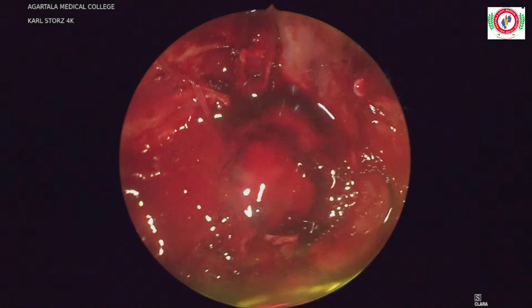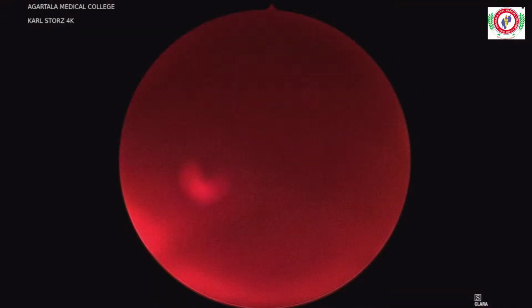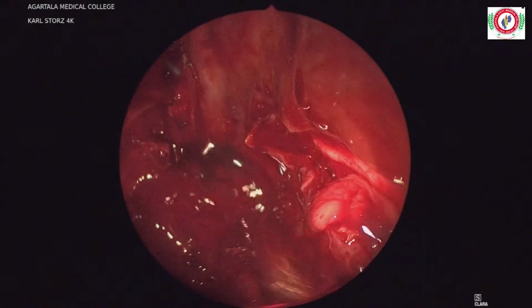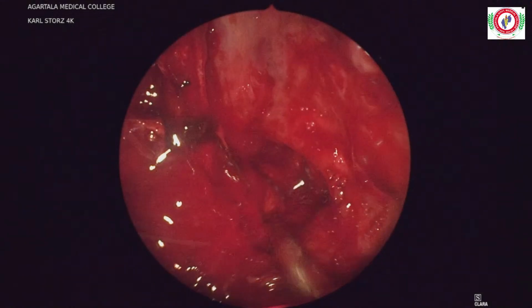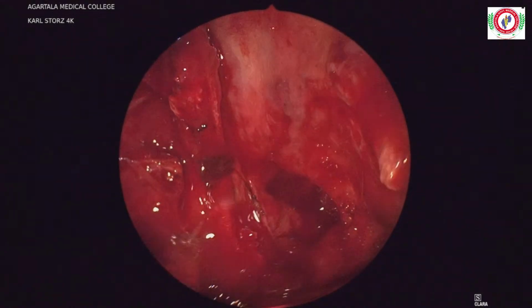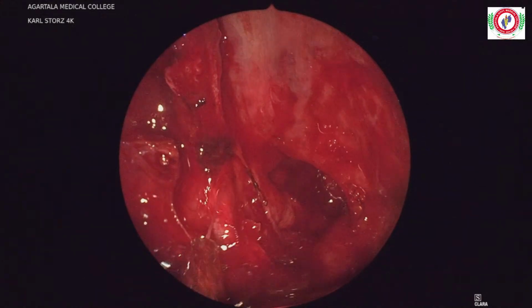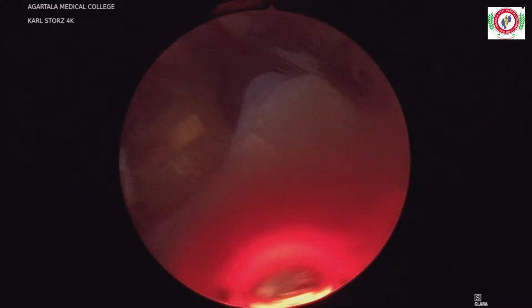No, it's not bleeding much. The only thing is that the instrumentation is not working. There is some problem with the suction, I think. The suction is causing the problem. That is why I think the debrider is not working. It is getting blocked again and again.